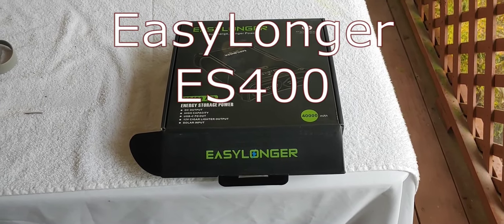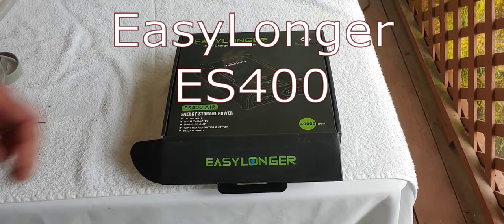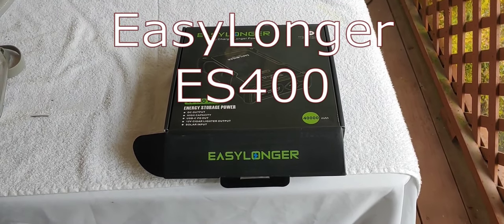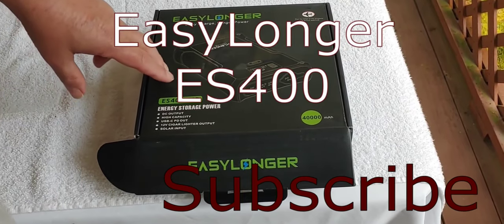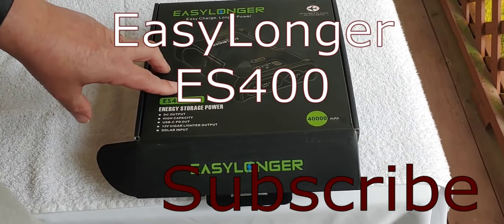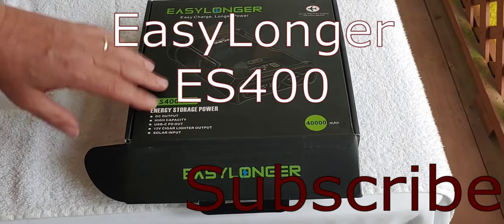Shoestring here. Last video I did on one of these EasyLongers, I did on the ES960. This one I'm doing the ES400 Air because it is a less expensive alternative and it still basically does the same thing.